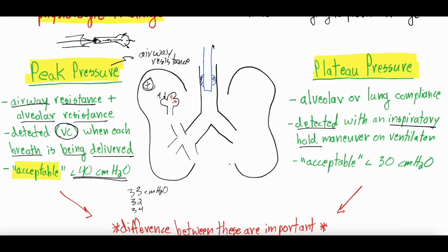I'm going to redraw, right? The endotracheal tube comes out the mouth. There's this tubing, right out the mouth. There's this tubing, and it goes onto the ventilator. And again, this is a closed circuit.